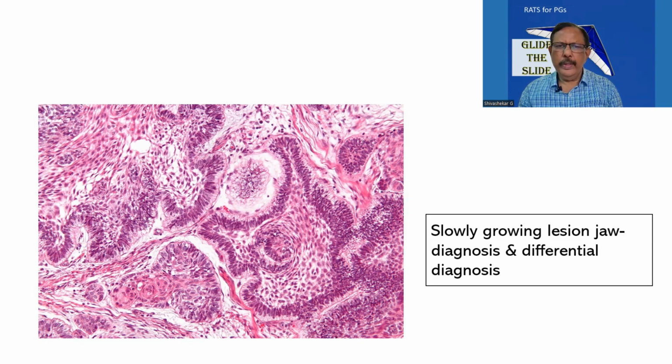It is very direct because I have mentioned the site. But then there is a catch. I would like you people to diagnose, differentiate, and describe. So these are the three commitments for you people. I hope that we shall make the best out of it.